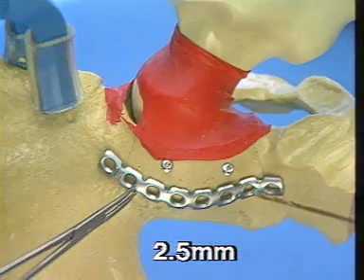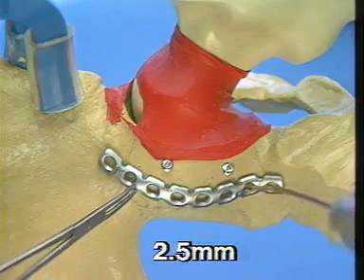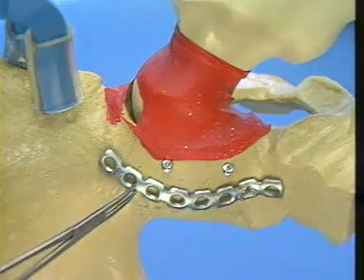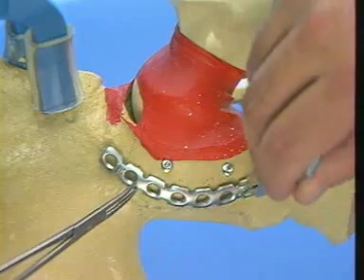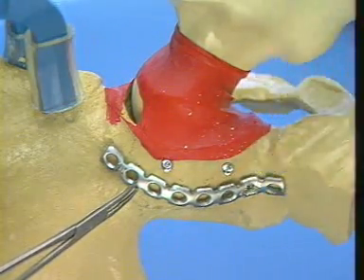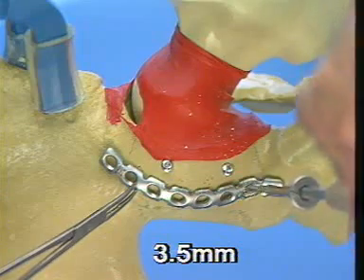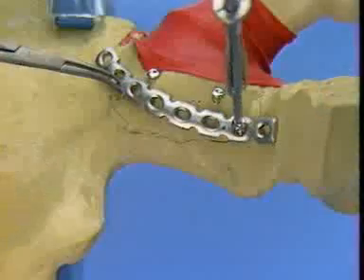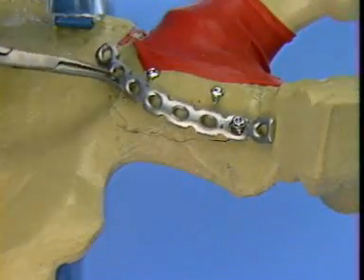Place the screw into the hole that lies in the concavity of the plate, just above the ischial tuberosity. This is a 3.5 millimeter screw and a 2.5 millimeter drill bit. Measure the depth with the depth gauge and insert the screw. The screw is incompletely tightened to allow positioning of the plate.